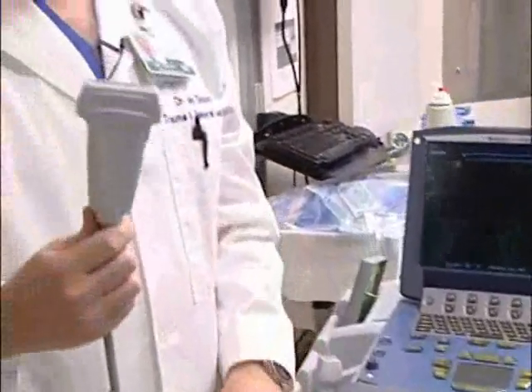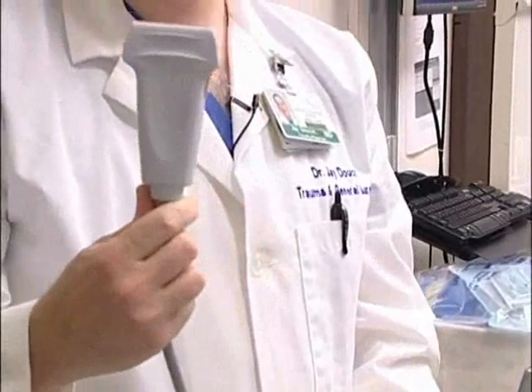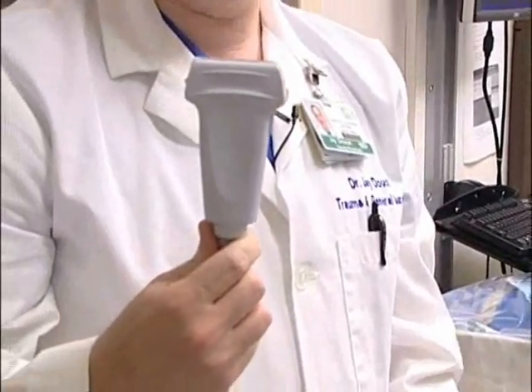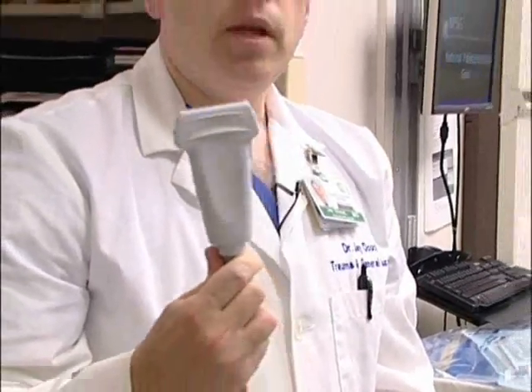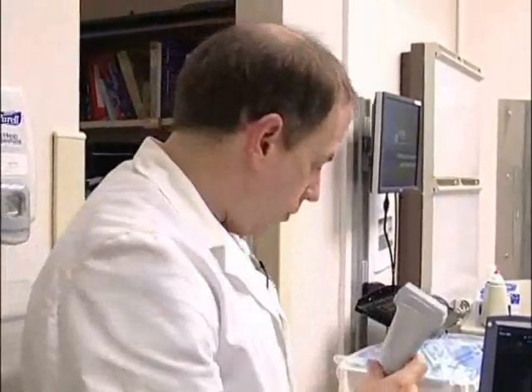Each of these probes is worth over $10,000, and they can be easily damaged by dropping them or by running over the cords with the ultrasound machine. At all times during insertion of a central line, you must have control of the transducer and ensure it does not fall on the floor. Also, when moving the machine or securing it, ensure that the transducer cords are properly locked up and will not come to grief with the wheels of the machine or by being pulled out of the machine.